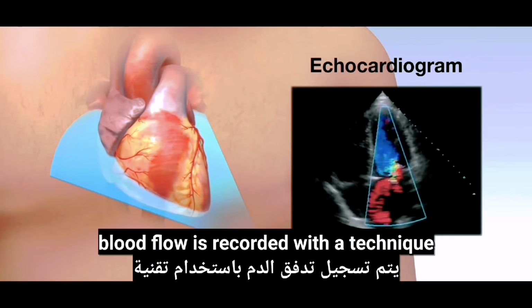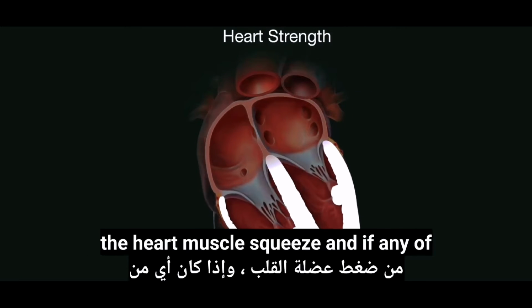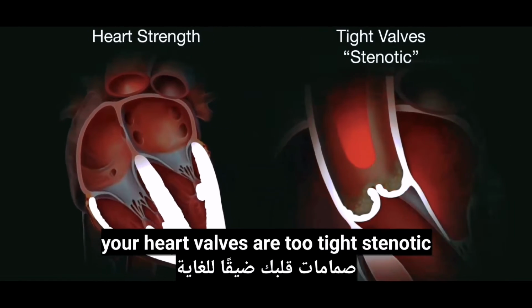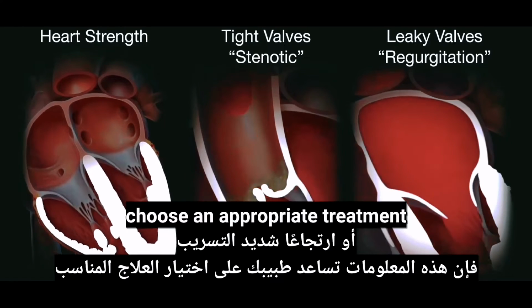Blood flow is recorded with a technique called color Doppler. The echocardiogram shows the strength of the heart muscle squeeze and if any of your heart valves are too tight, stenotic, or too leaky, regurgitation. This information helps your physician choose an appropriate treatment.